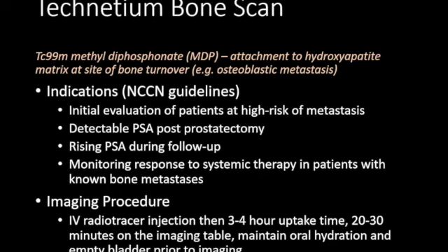This imaging procedure involves an IV injection of the radiotracer followed by a 3 to 4 hour uptake time. The imaging itself takes approximately 20 to 30 minutes, and the patient is instructed to maintain oral hydration and empty their bladder prior to imaging.